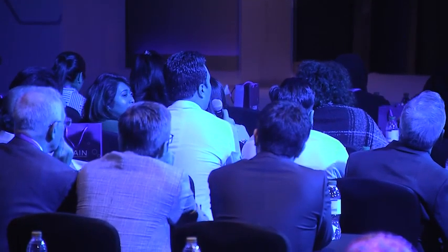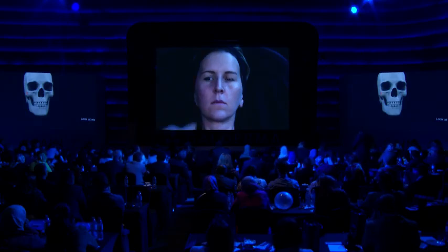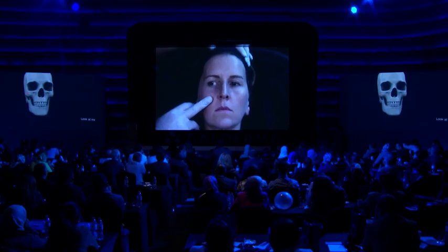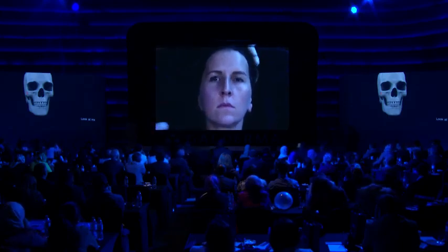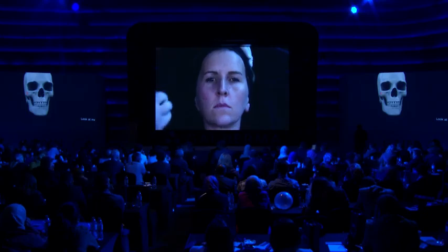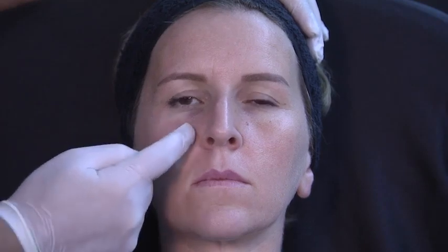My question is, while we consider the budget, if budget is an issue, do we think that going with the needle with bolus technique would have been much more beneficial than opting for the cannula? Right, you mean for the mid phase, yes? Yes. So I agree that when we use needles and we do a bolus technique, we might need less product. But to be honest, with only 0.5 here, you will not have an excellent result.